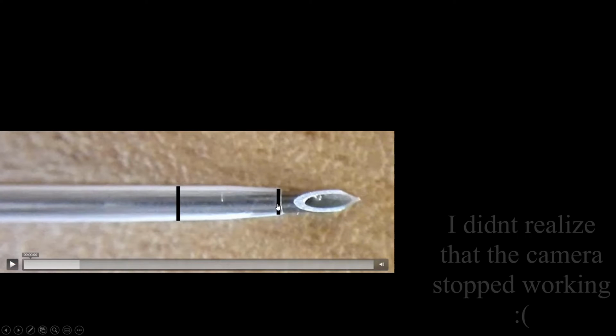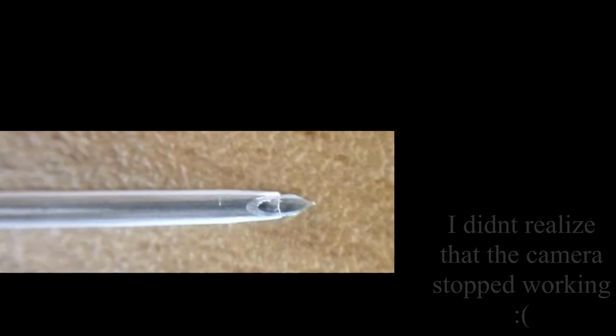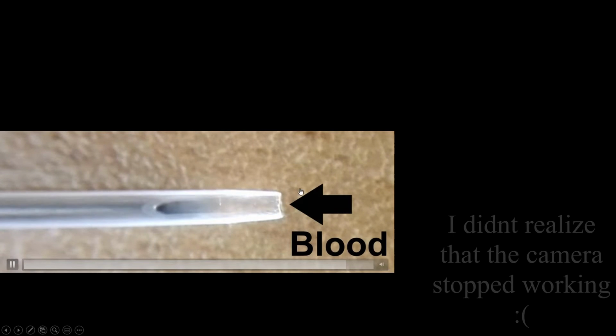So you can see the black bars, they represent the diameter of the cannula, the narrower tip and the wider body, and these are placed together so that you can compare the sizes. You can see there's a marked difference between the diameter of the cannula tip and the body. And when the stylet is pulled back, that watertight seal is broken and the blood is being pushed inside. Hence we see a second flashback inside the cannula.